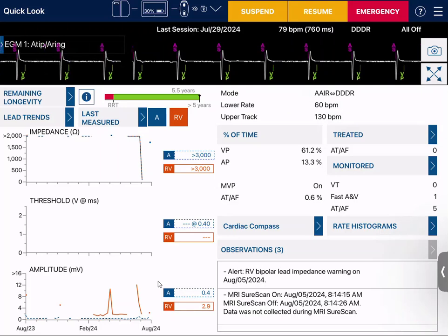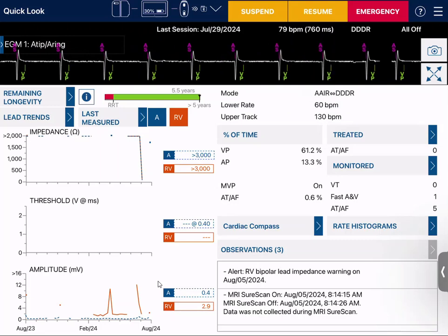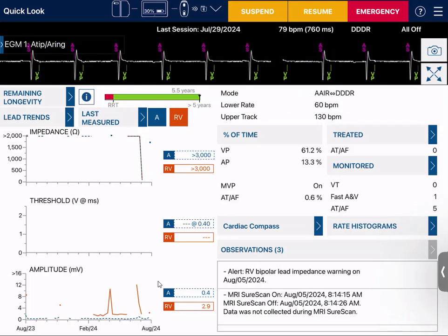First, we're going to interrogate the patient. We're going to come to our quick look screen and look at our presenting rhythm. We can see the patient is A-sensed and V-paced, so we know that they have some sort of A-V block.